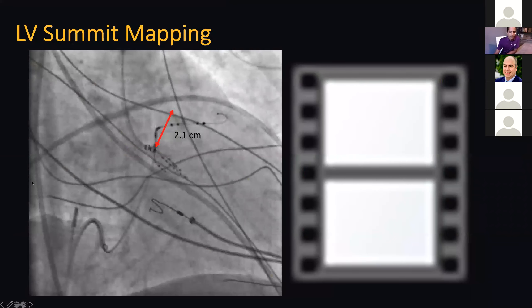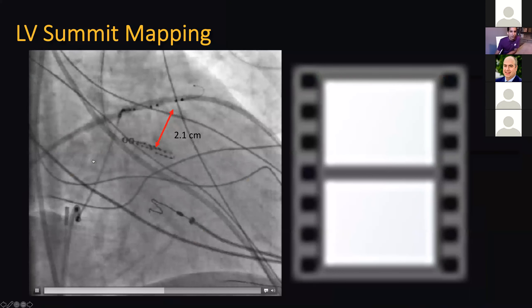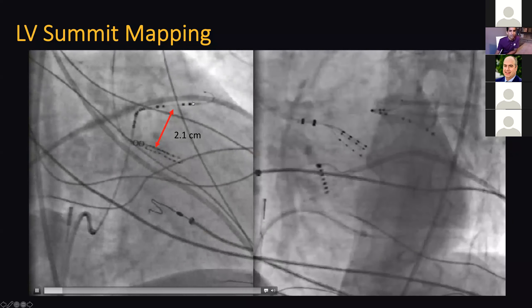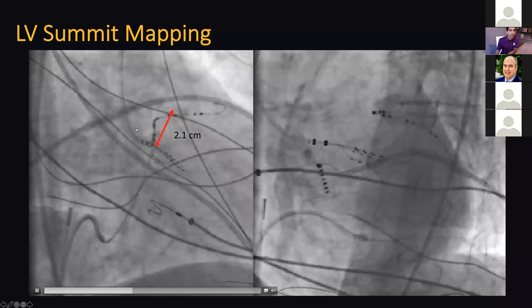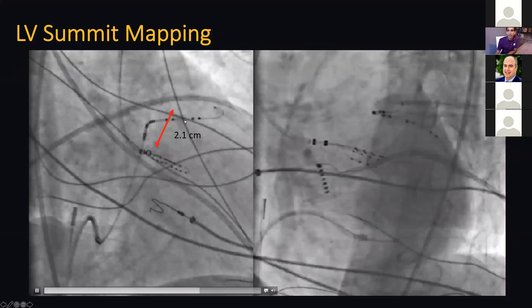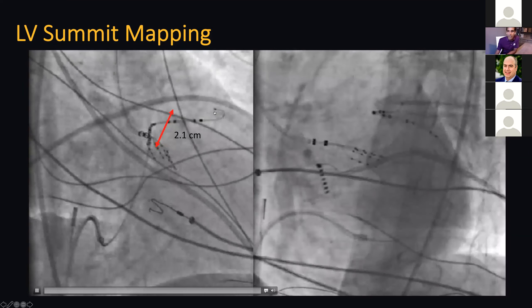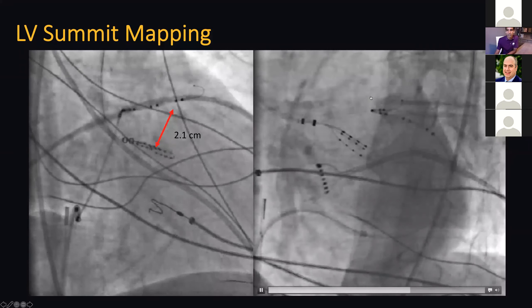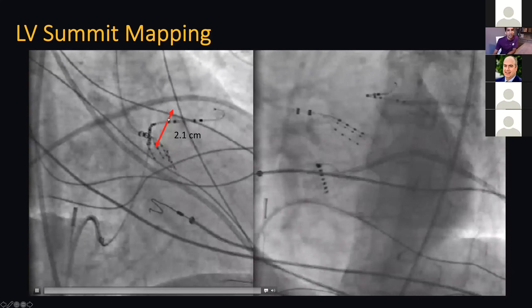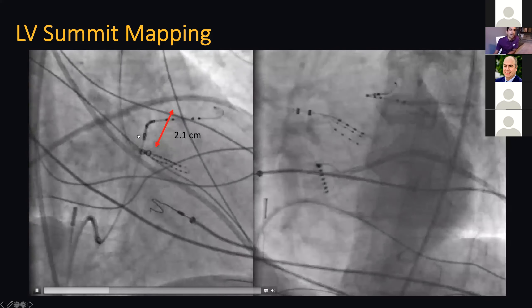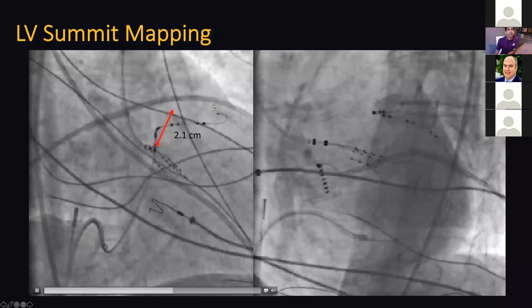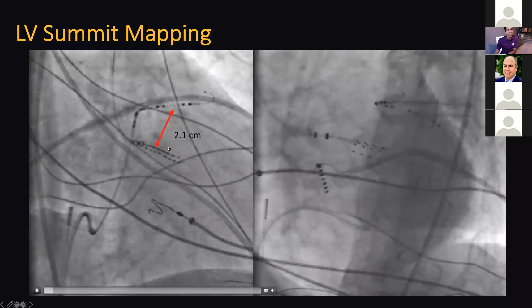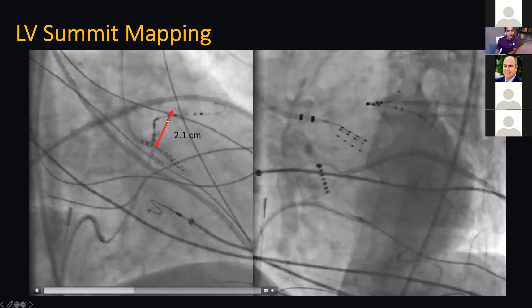Here's the view of the catheter in the LV summit. The map catheter is in the LV summit branch — it's not going straight down in the LAO, it's coming towards you, so maybe in one of the other branches. Either way it's in the region of the LV summit. Here's the HD grid just underneath it. Look how thick this structure can be — up to about two centimeters.